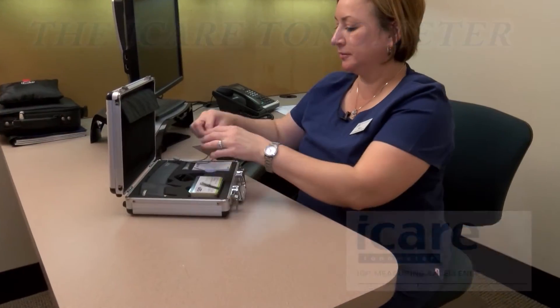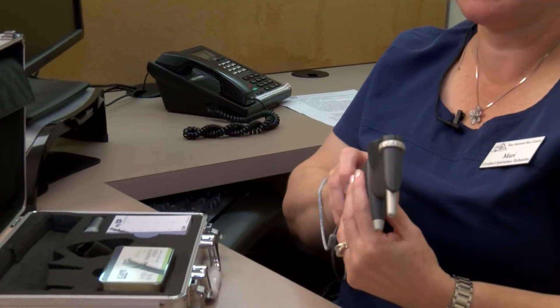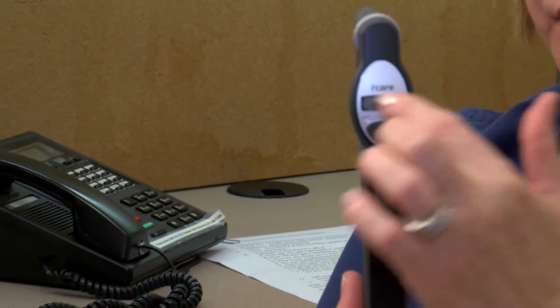We're going to take our iCare tonometer, get it ready to use and load. Press the button once — it says 'on.' And then it beeps on its own when it's ready to load. It says 'load.'